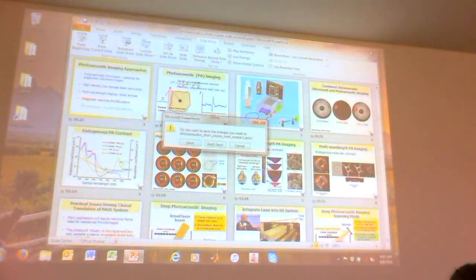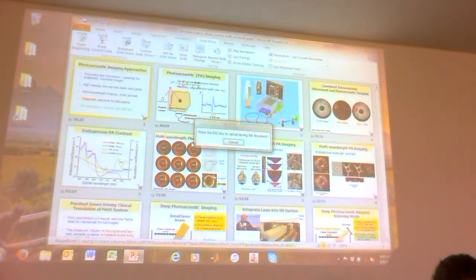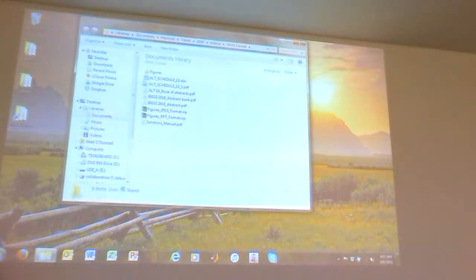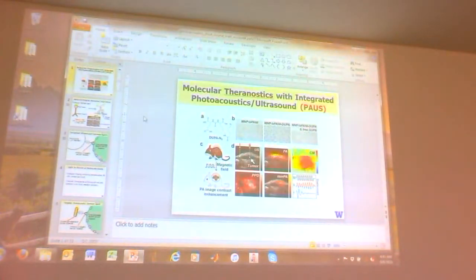So we're really starting to use acoustics, and Matt's brought it right around so that we are also incorporating the light. The point is that this is how we get to use the diffuse light. We saw from David Rose that you could use diffuse light directly, but then you get resolutions, as Matt was saying, of the order of 1 centimeter. Here with photoacoustic, I'm not sure if I dare say tomography. You can say whatever you want to call it. But with 3D photoacoustics, we're getting resolutions that are much better than that.